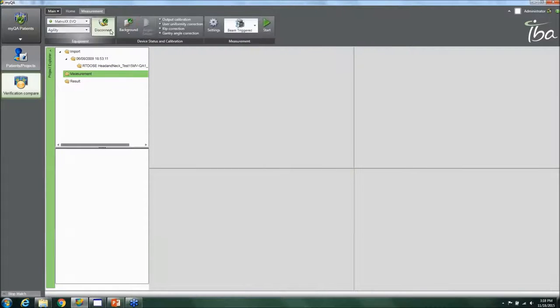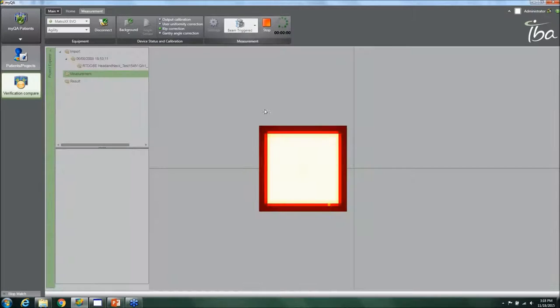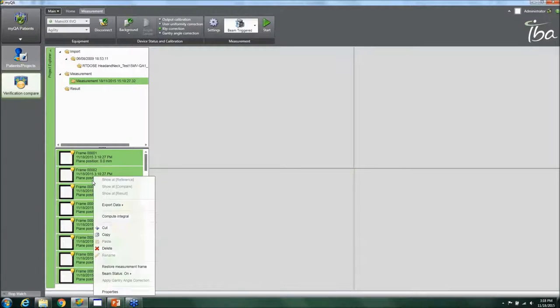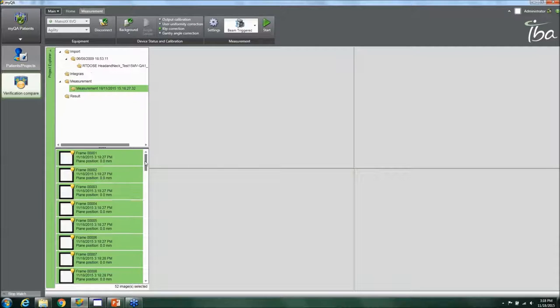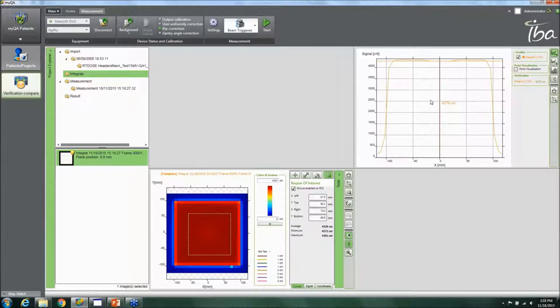Once you have the device set up, you can take a measurement. With beam trigger mode, you click Start and it takes a measurement showing what's being delivered in real time. Once you click Stop, you see all the different frames that were delivered. You can copy frames, export them, or compute an integral frame, which is very useful. You then pull the integral frame into the comparison view and look at your dose profile alongside the imported reference dose.